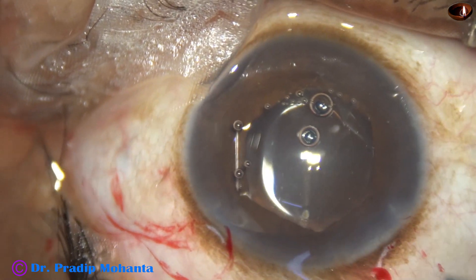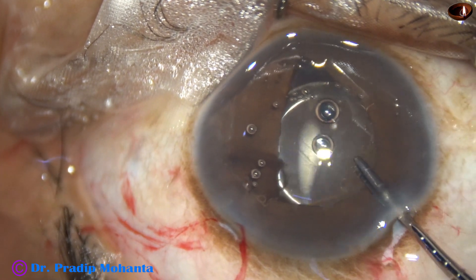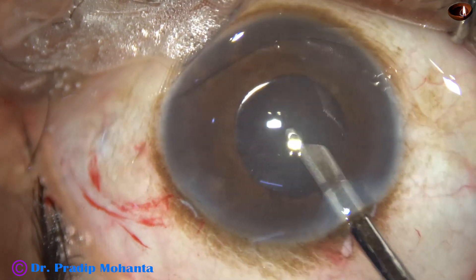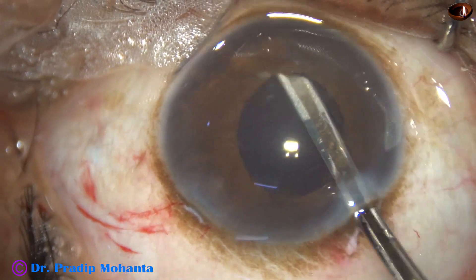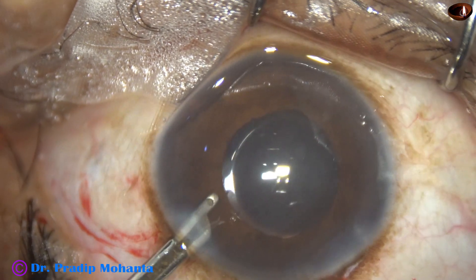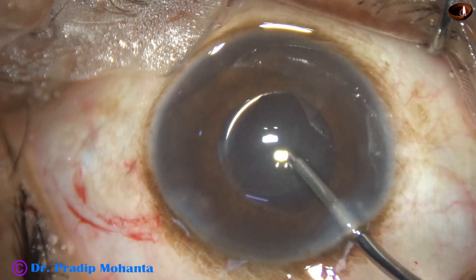Now the B-hex ring is removed. The flange at 4 o'clock is held, the B-hex ring is mobilized, untucked, and removed. The viscoelastic filling the entire anterior chamber as well as the capsular bag is now removed. We must go behind the intraocular lens and irrigate the capsular bag to remove all the visco trapped behind the IOL — otherwise, that visco between the posterior capsule and the intraocular lens can increase intraocular pressure and cause steamy corneal edema.